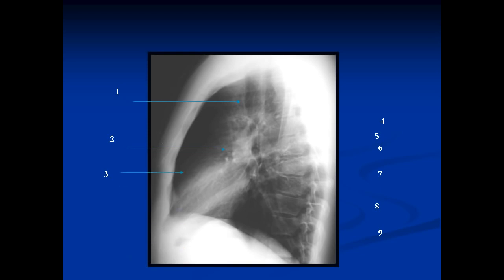The heart border on the lateral view that's in front is the right ventricle. It should be no more than about a third of the way behind the sternum — if it's bigger than that, then the right ventricle is enlarged. This white area here is formed by the arch of the aorta. This other white area here is the left pulmonary artery, which goes up and over the bronchus. This is the bronchus to the left upper lobe, which we see as a round hole end on. The pulmonary artery sits above it.